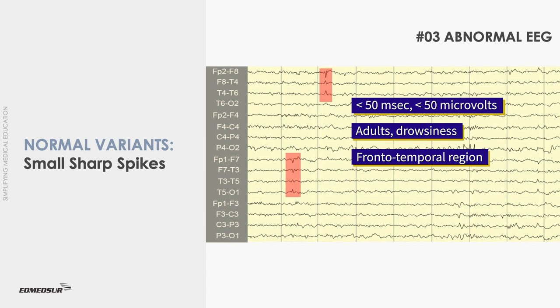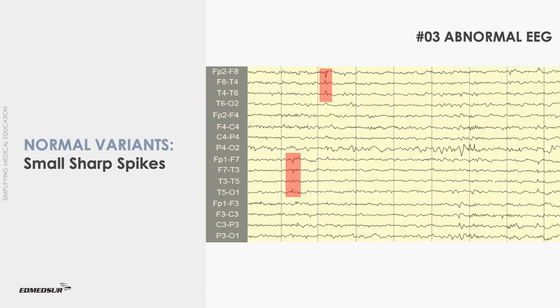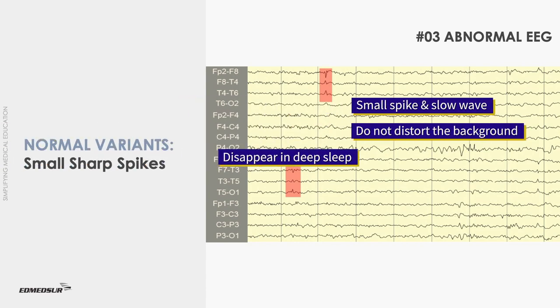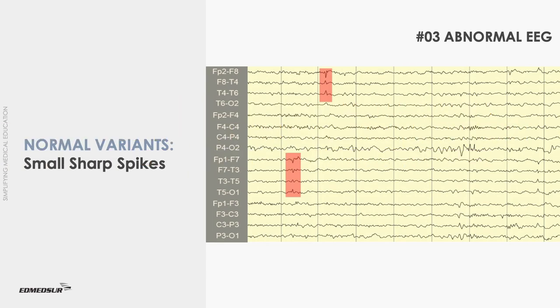They are seen in adults during drowsiness and light sleep, located in the frontal temporal regions, unilaterally or bilaterally in an independent manner. They are sometimes immediately followed by a waveform in the theta or alpha frequency range, creating the appearance of a small spike in slow wave complex. Unlike epileptiform discharges, they do not distort the background and have a tendency to disappear during deeper levels of sleep.